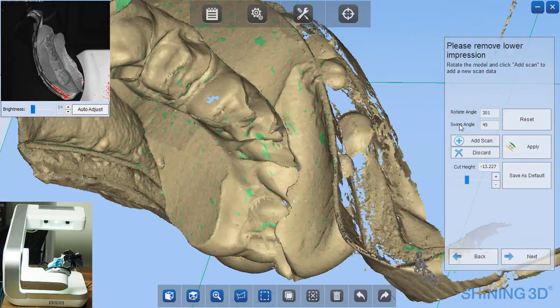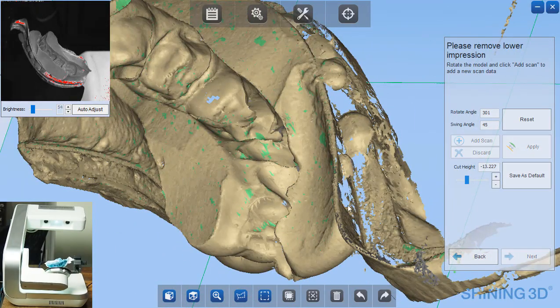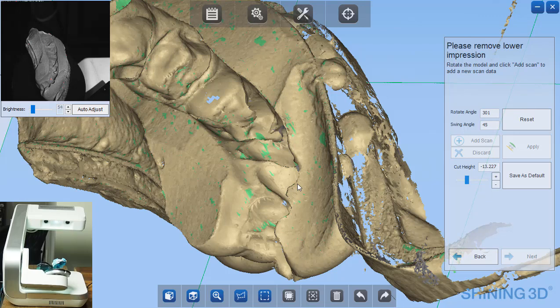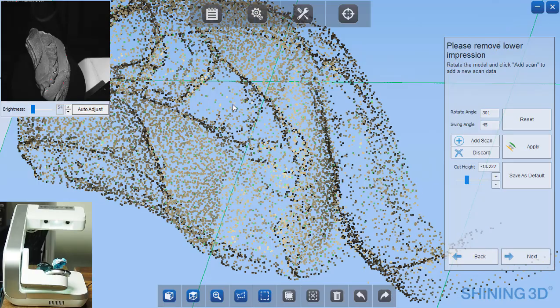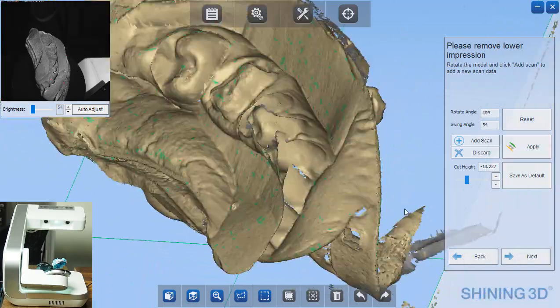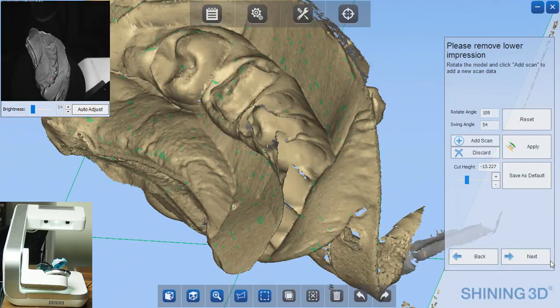As you can see, there's a little area missing on the contact point. So I'm going to add scan data there and you will see that be filled in by the next set of images. And now it's filled in.